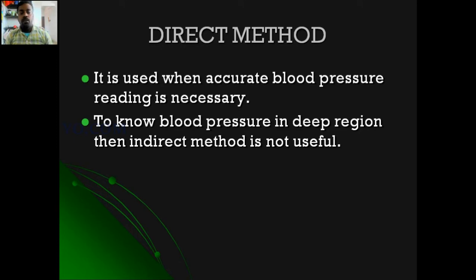To overcome that, we use the direct method. It is used to measure the blood pressure in deep regions, where the indirect method is not useful.